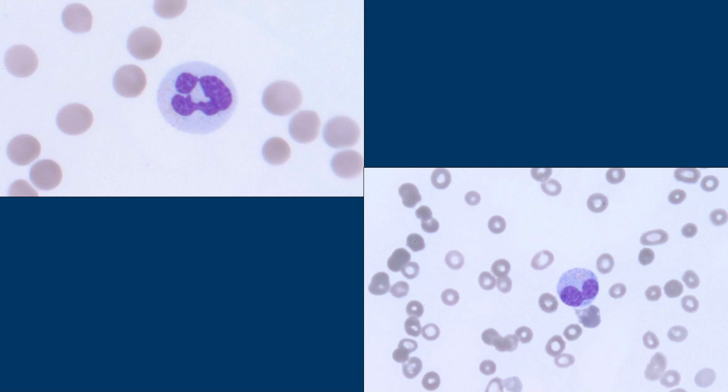It's not growing the right way. Instead of saying dysplastic, I'm saying dyspoietic, meaning that there is a problem in the formation — the dyspoiesis. Poiesis: granulopoiesis means the formation of granulocytes, erythropoiesis means the maturation of erythrocytes. So dyspoiesis means it's not forming the right way. So this is also hypogranular, but is hyposegmented.